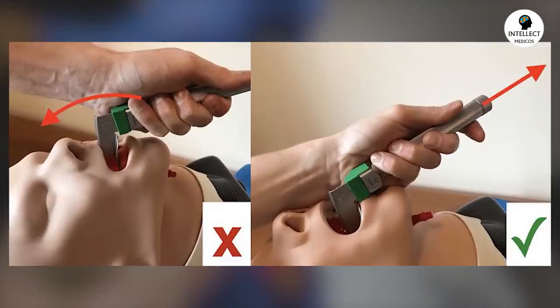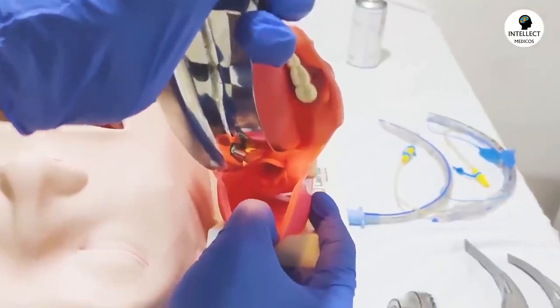So when you reach the vallecula, you don't have to twist your hand. You just have to pull it at a 45 degrees angle as shown in this pic. Because if you hinge it or if you use the incisors as a lever, then you can cause trauma to the teeth or even break the teeth. So never twist your hand, just pull it at a 45 degrees angle so that you are able to see the vocal cords over there.